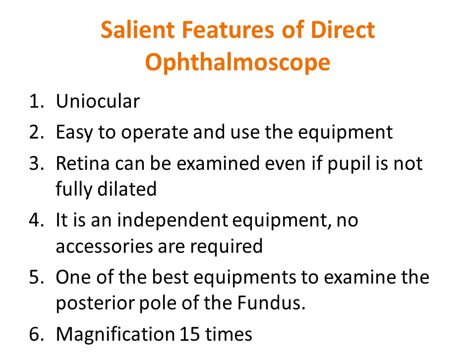It is an independent equipment and no accessories are required. Like in other equipments, you need a lot of accessories; here, no accessories are required. Only the equipment is enough to examine various details of the posterior segment. It is one of the best equipments to examine the posterior pole of the fundus. When I say posterior pole of the fundus, it includes the optic disc, macula, the superior temporal and inferior temporal arterial arcades, and the area close to the optic disc and the macula.